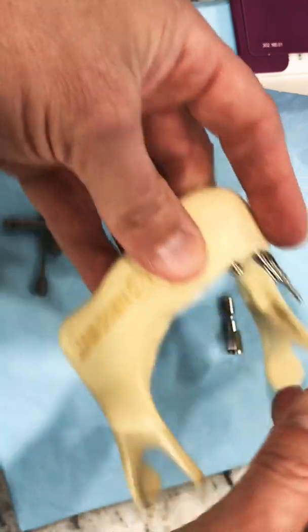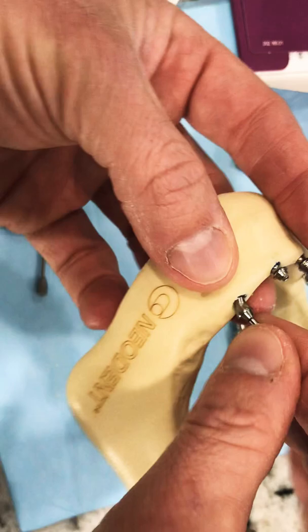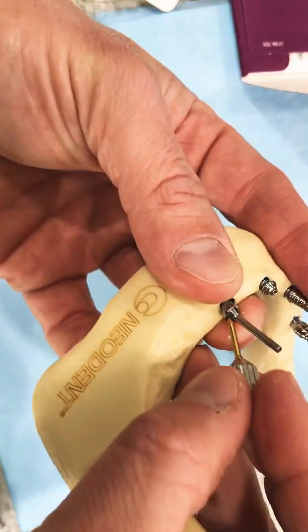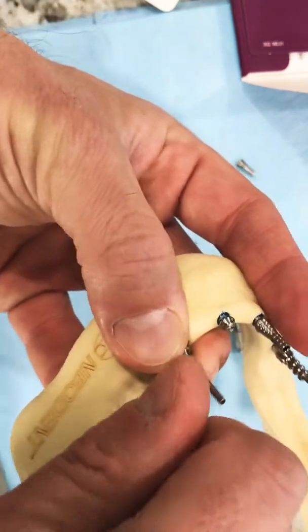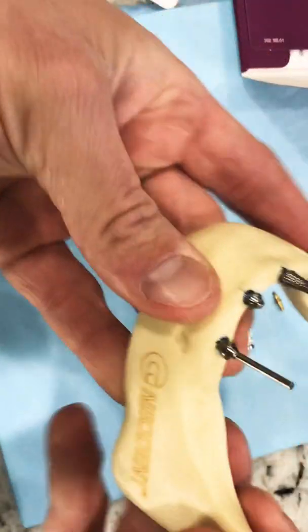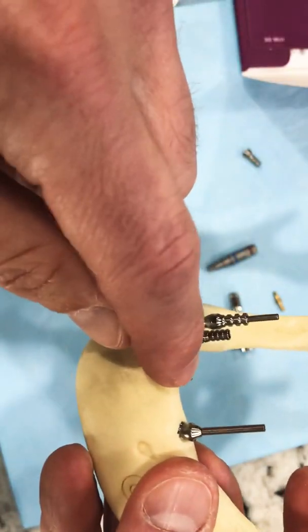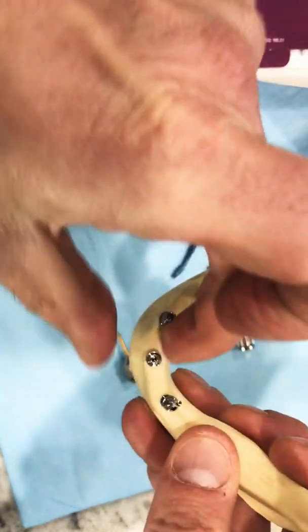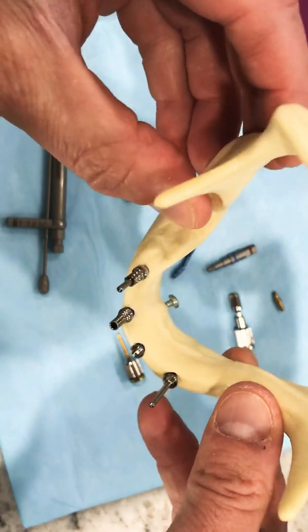I'm going to remove that pin. Now when I go back, I should be able to place my abutment without any interference. When I get this guy to go down and I'm engaging the hex inside my implant — great success. Now I've got one, two, three, four, and they're all darn near close to parallel. It's an easier path of draw when I seat my temporary or my final prosthesis. Thanks, folks.